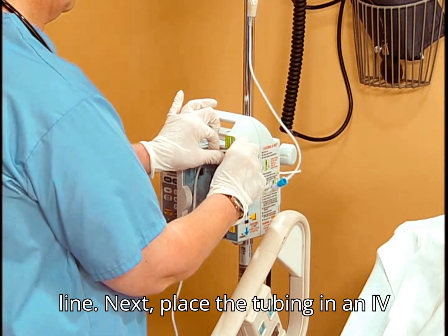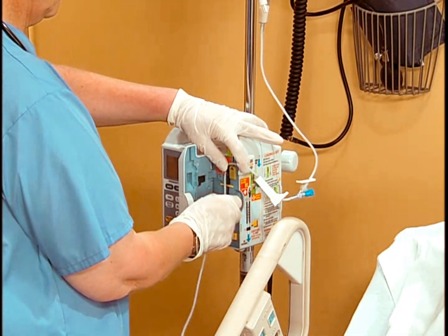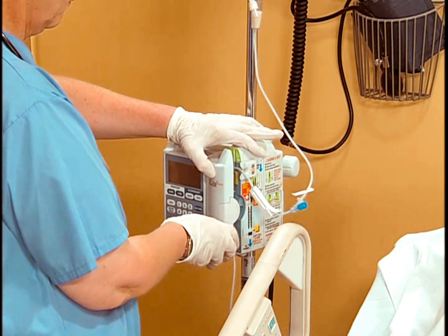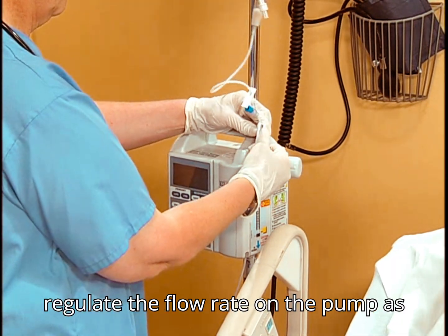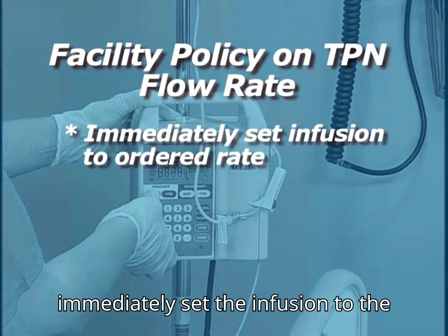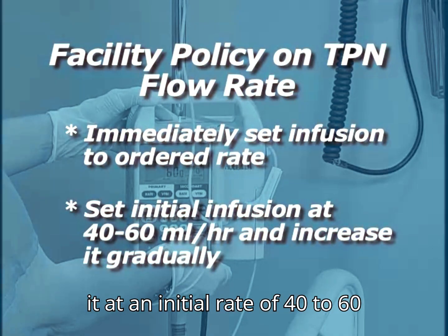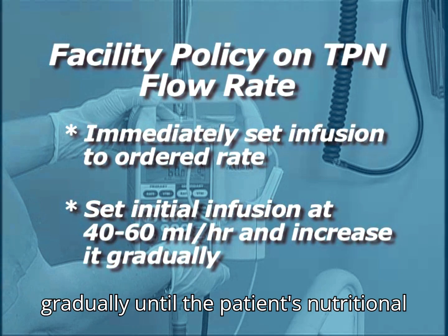Next, place the tubing in an IV infusion pump. Open the roller clamp completely and regulate the flow rate on the pump as ordered. Depending on facility policy, immediately set the infusion to the ordered rate, or set it at an initial rate of 40 to 60 milliliters per hour and increase it gradually until the patient's nutritional needs are met.